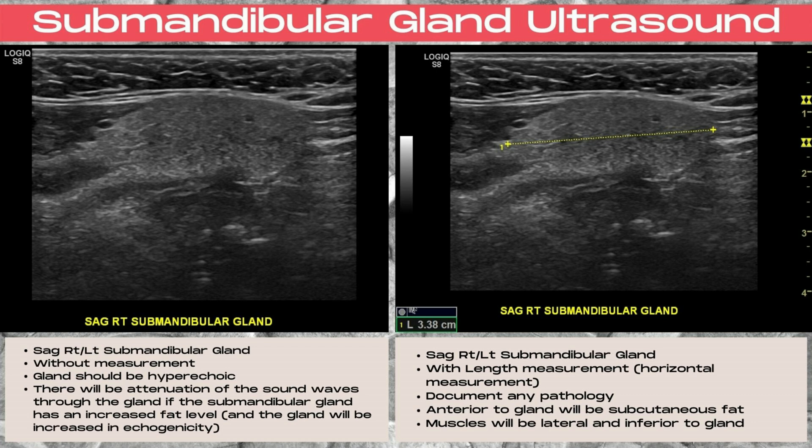The tongue also may or may not be visualized inferiorly to the submandibular gland. The gland should be hyperechoic, but will be brighter white with more attenuation of the sound waves, the fattier the gland appears on ultrasound.